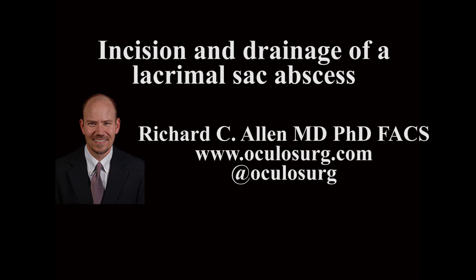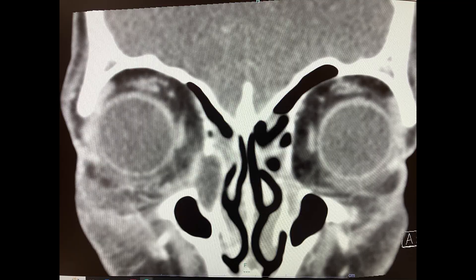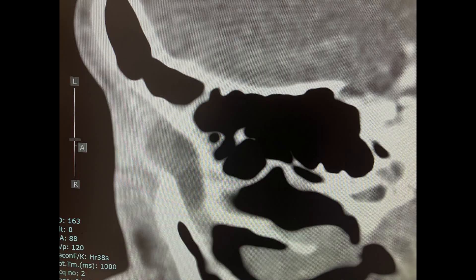This is Richard Allen at oculusurge.com. This video demonstrates incision and drainage of a lacrimal sac abscess. Imaging shows the dilated lacrimal sac with an abscess that extends down the nasolacrimal duct.